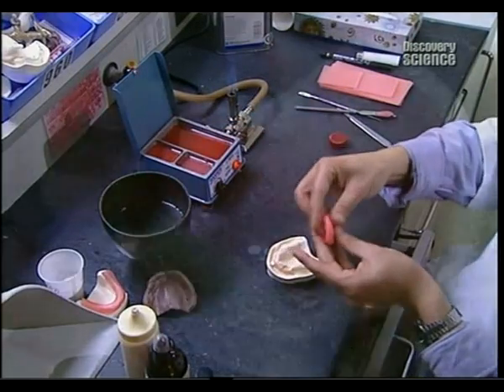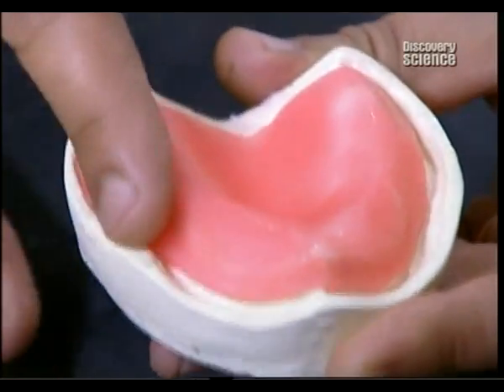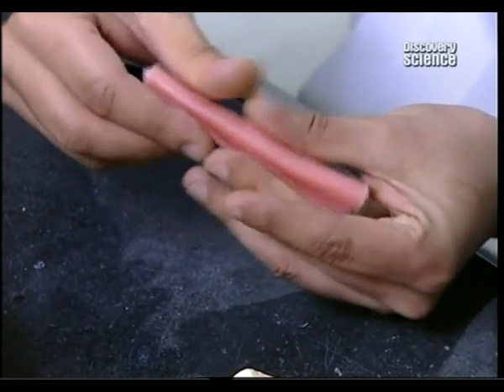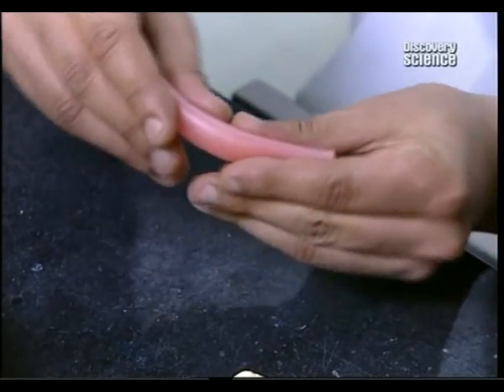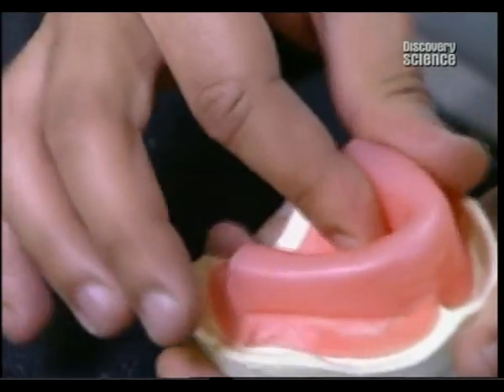A special orthodontic acrylic is pressed into the model to form what's called the base plate. Then a sheet of wax is heated to form the rim of the base. This new acrylic and wax model now goes back for another fitting in the patient's mouth.